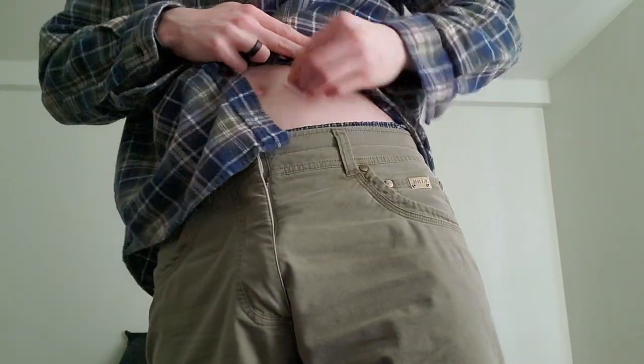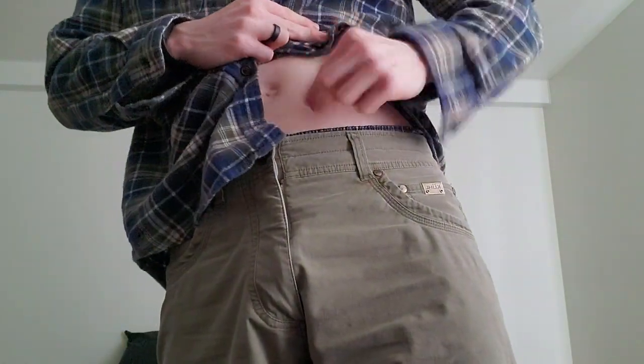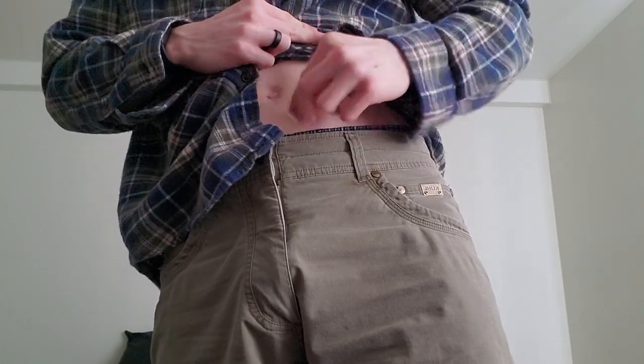So for me, I'm going to use my alcohol wipe on the lower part of my stomach right here. Just wipe it down. Make sure it's nice and clean.